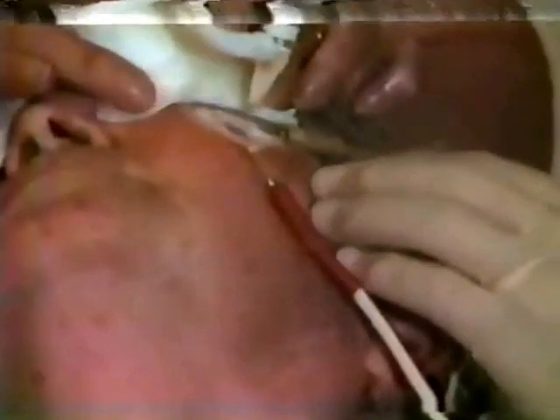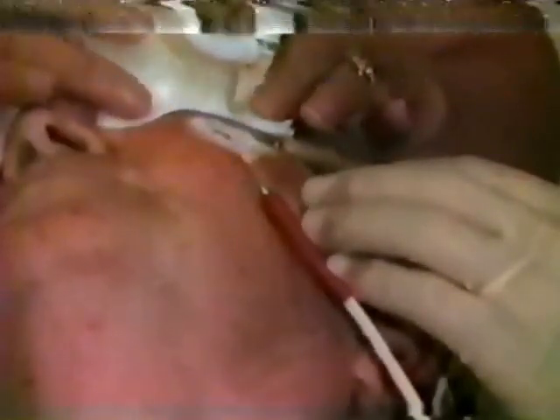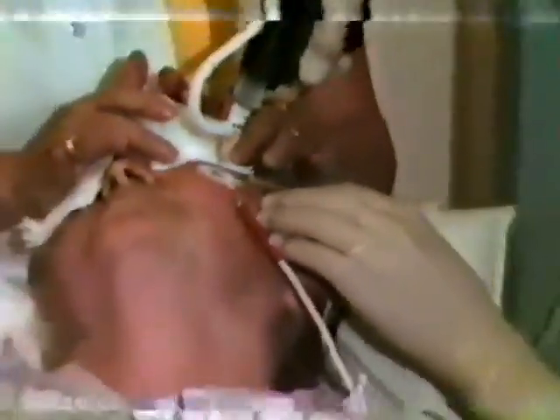Turn to the other channel, Joyce, please. What is it reading now? Plus. A little louder, I can't hear you. You're a plus. You're above zero. Now you're minus 40.